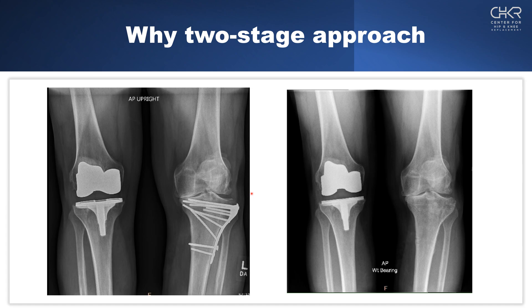While the majority of the time we'll do everything in a one-stage approach and deal with the hardware at the time of the knee replacement, occasionally we'll come across a situation like this — post-traumatic arthritis with either a distal femoral or tibial plateau fracture fixed with ORIF plates and screws. We're not just removing one or two screws through a small percutaneous incision. There's a large plate, dozens of screws, and we have to come all the way down because some screws have been placed diagonally from distal all the way to proximal. It's not just in one plane — this is an L-shaped plate, so the screws are in multiple planes.